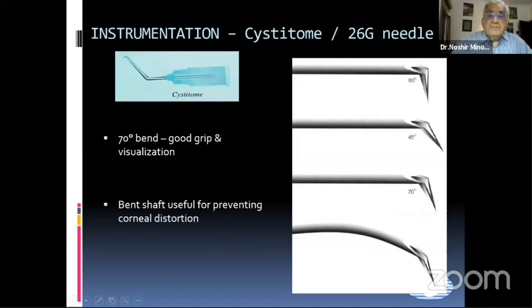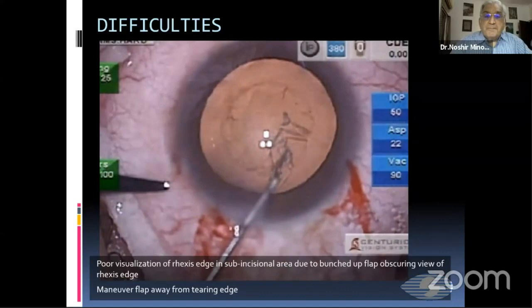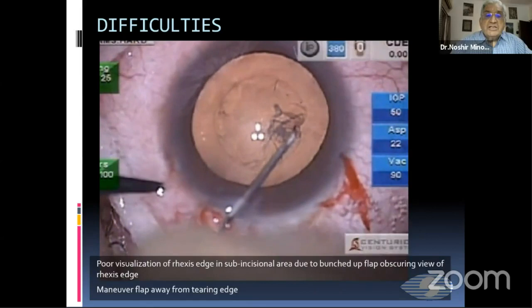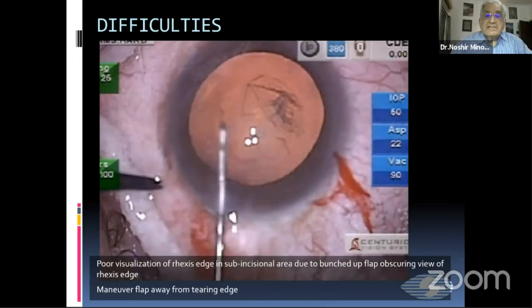I am starting my presentation and will show you only the surgeries. This is a poor visualization of the capsulorhexis because it got bunched up. You can see that it has got bunched up and you cannot see the edge very well. So what you have to do is inject viscoelastic as much as possible so that you are able to see the edge of the capsulorhexis very well.